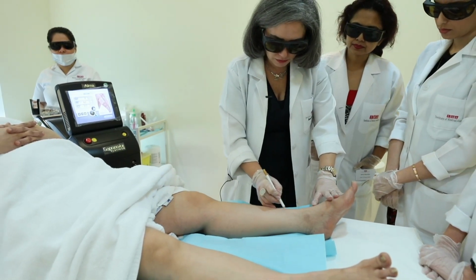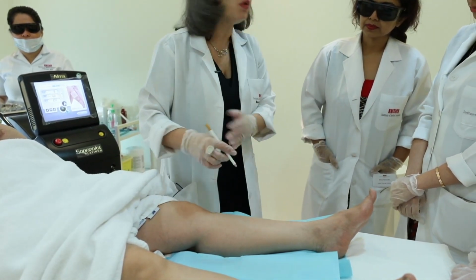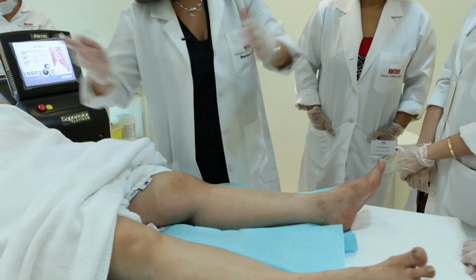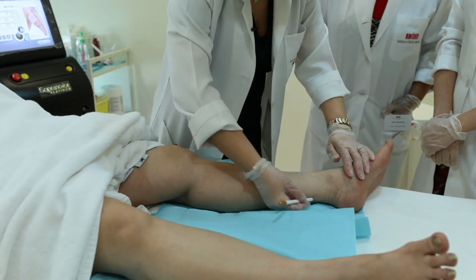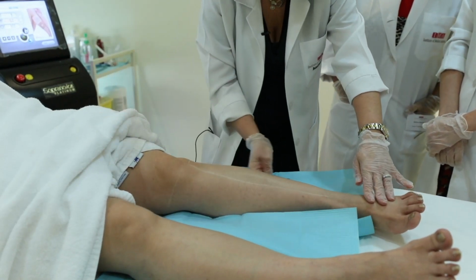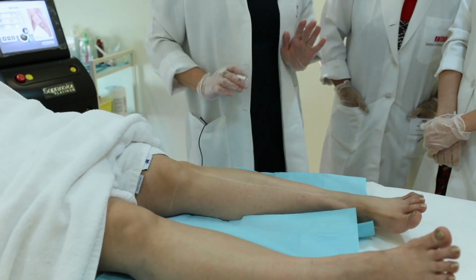With the white pencil, I will put a line in the midline. More or less, I know that the majority of ladies are not much taller than 30 centimeters, unless they're really tall. I want approximately 10 centimeters by 30 centimeters, which gives me the result of 300 square. So this one will be my first grid.